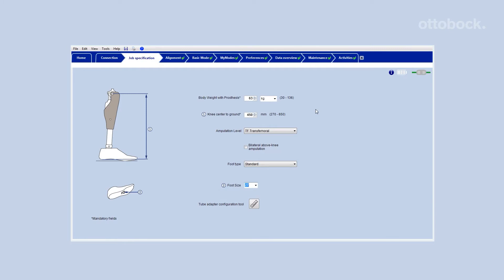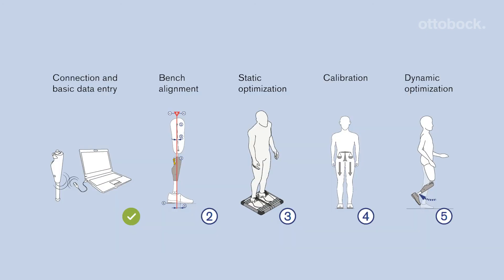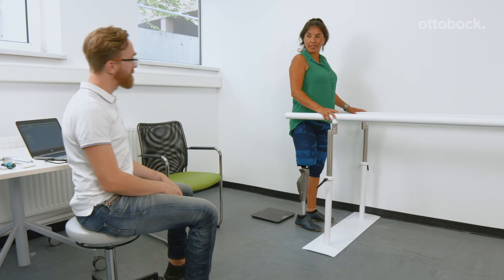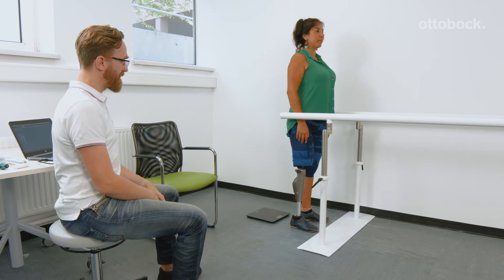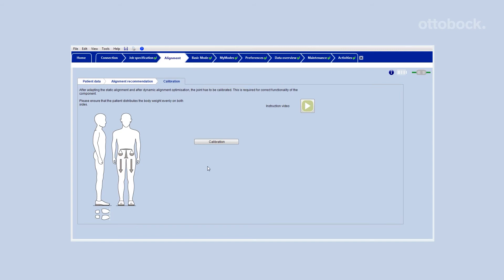Enter those values and all additional user data into SeaSoft Plus. After bench alignment and static optimization, it is necessary to calibrate the knee using SeaSoft Plus. Do not forget to recalibrate after every change of alignment.